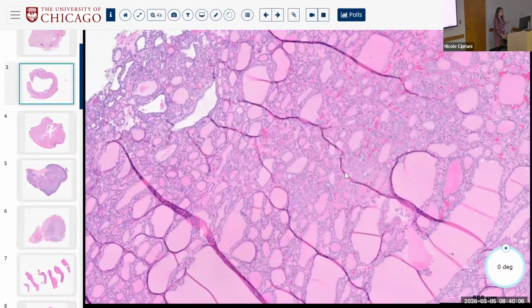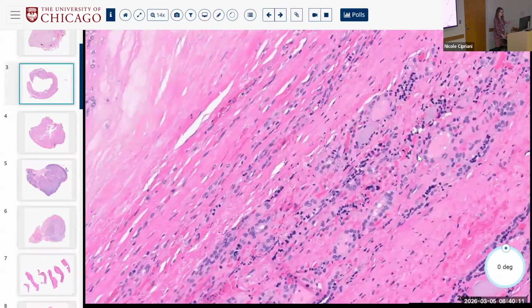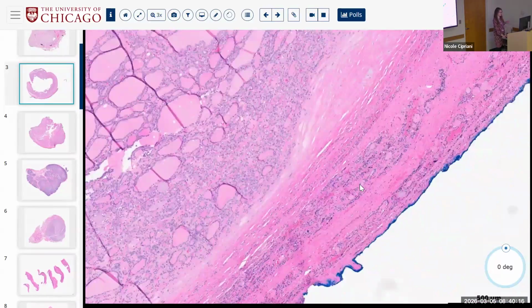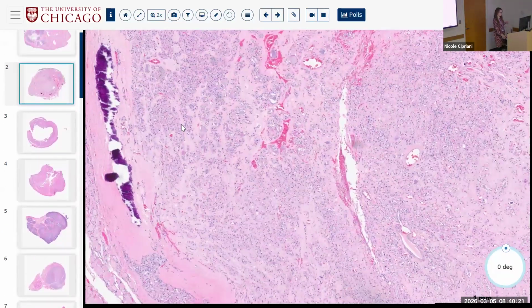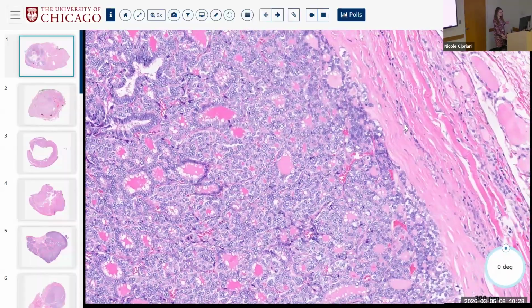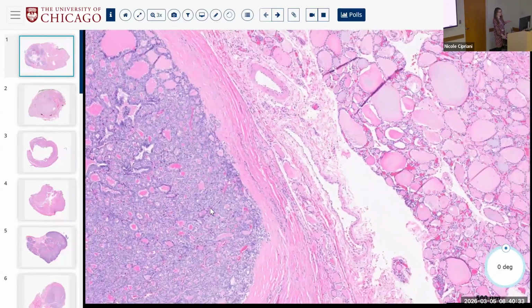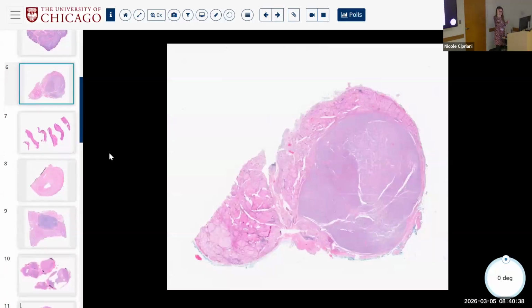This one had some nuclear clearing, not much going on in the background, but kind of different, right? So in this case, not helpful. That was kind of one. So just food for thought, right? Just food for thought in terms of comparison to the background. In all of these cases, the background was different from the tumor, so fine. Okay. Questions?